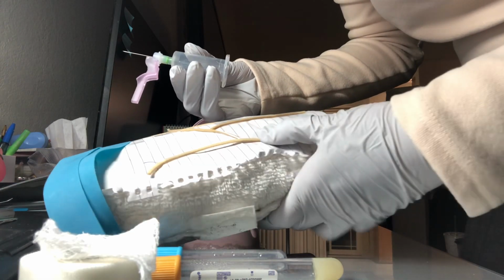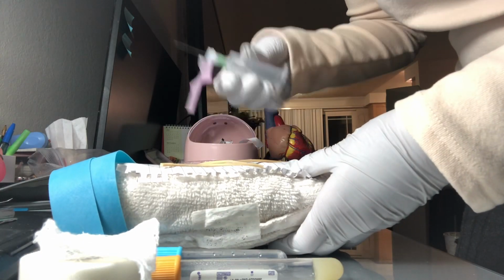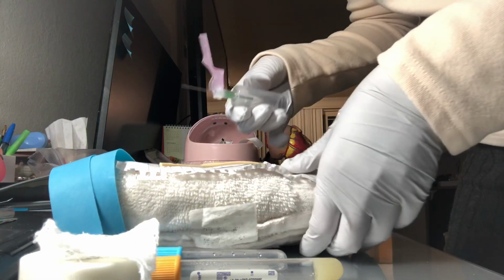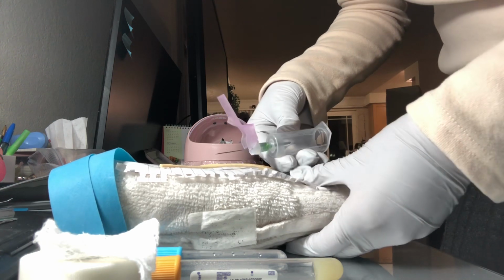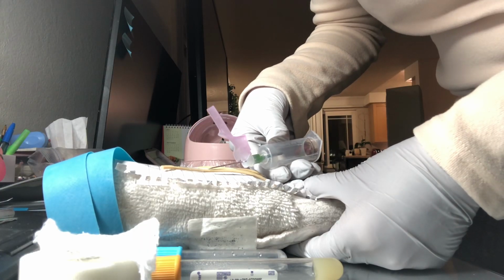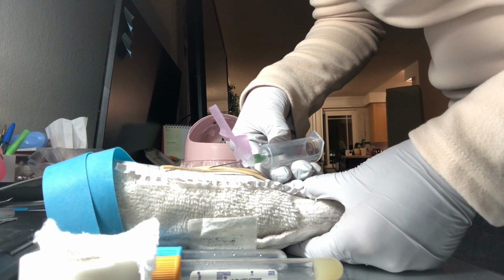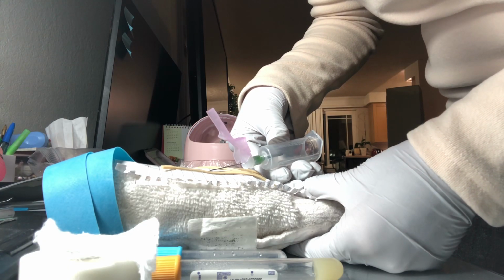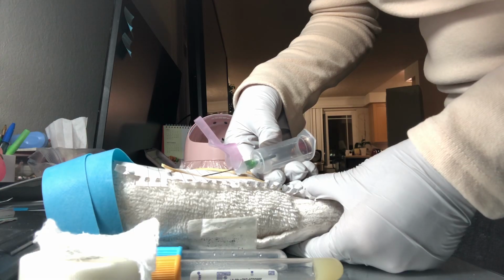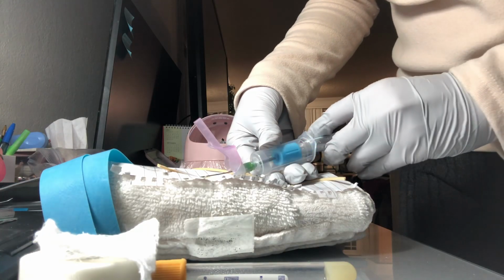I would anchor by pressing it down and moving it a little bit outside so I have space to insert a needle. Okay, this way with the bevel up. Now I have a good vision of the aim that I'm trying to get my needle into. I'm going to maintain my eye on that aim. And now I want to slide my needle inside the vein with a sweep motion. Now I'm going to insert the tube.